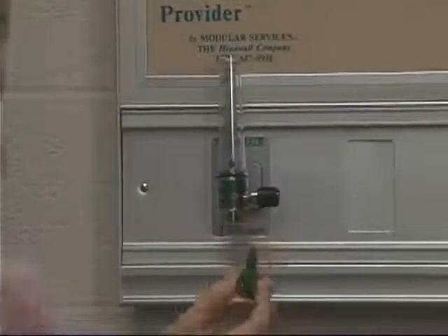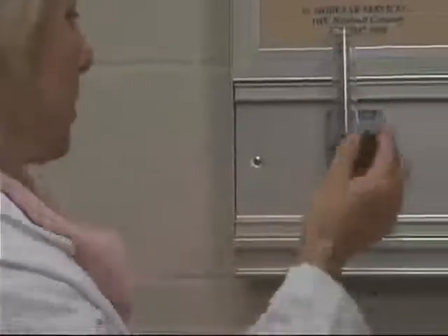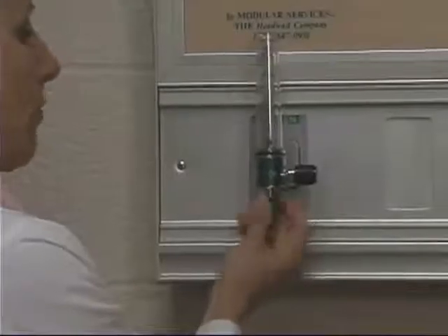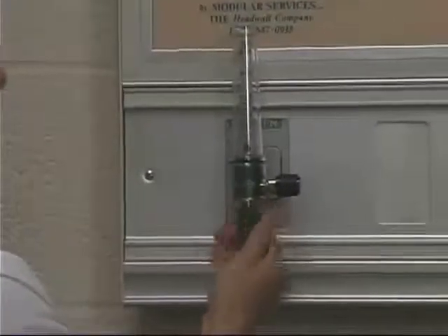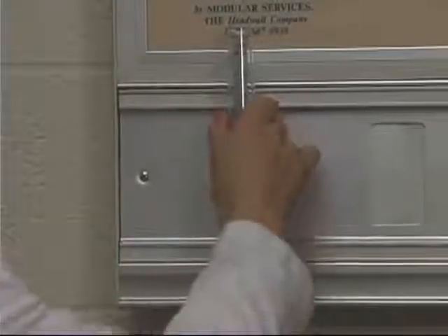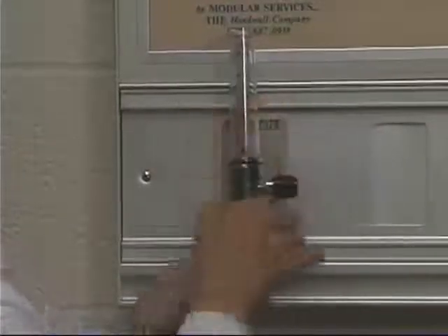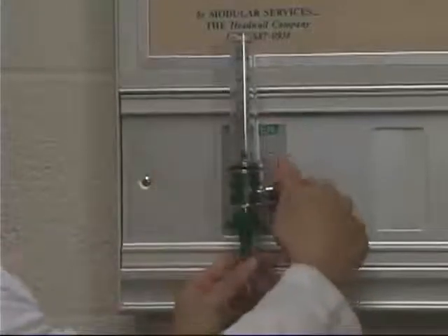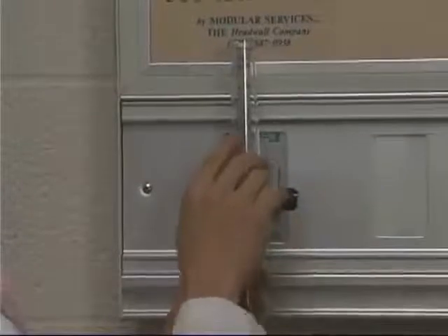You'll need this wing nut type device — it looks like a tree. These are usually already on the flow meter; if not, you'll need to get one. You'll need that because that's how you'll attach the tubing of the oxygen. Make sure that's secure, your wing nut is tight, and adjust the flow meter according to the order of how much oxygen you're going to deliver.